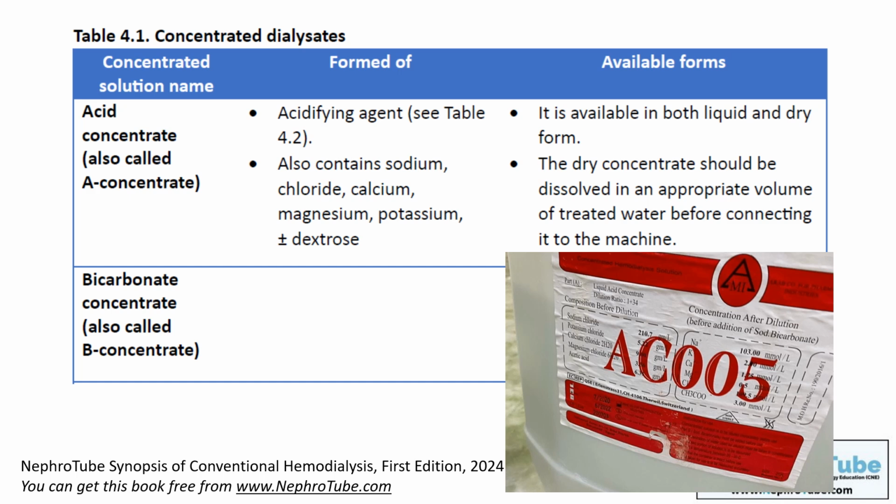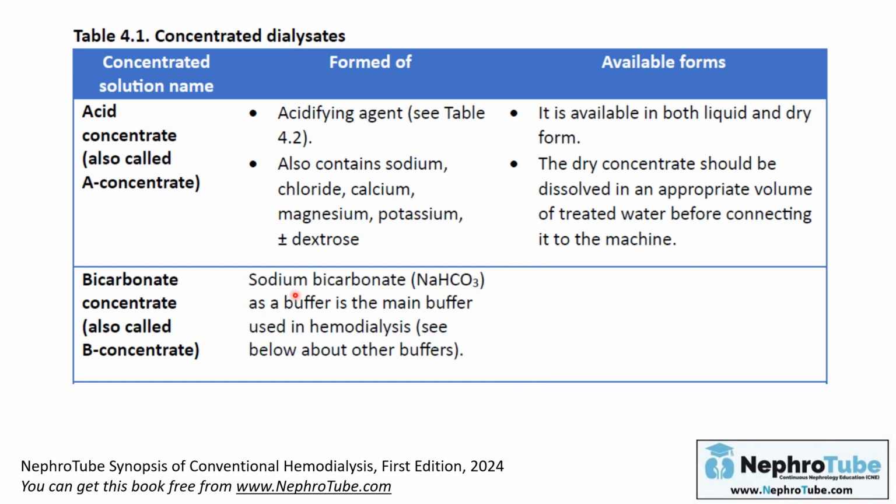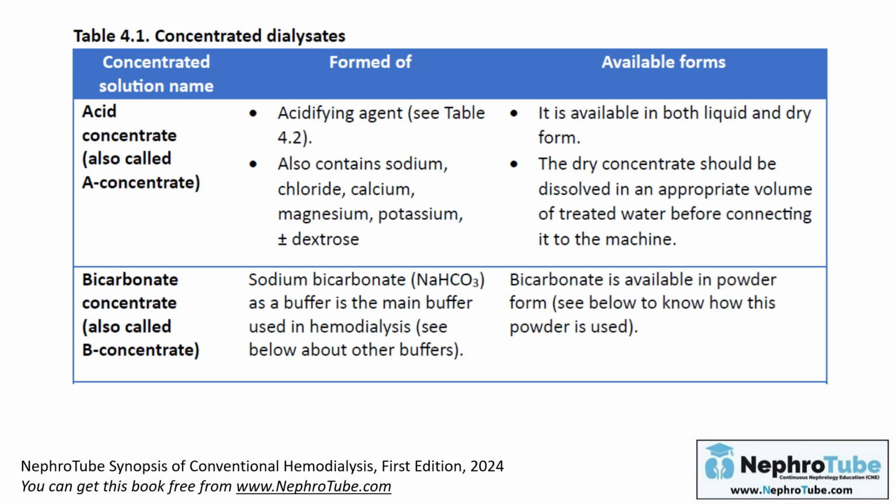Regarding the bicarbonate concentrate, sodium bicarbonate is the main buffer used in hemodialysis. There are other buffers that I will talk about later on within a few slides, but the main buffer that is used now in hemodialysis is the bicarbonate. The bicarbonate is available mainly in powder form.